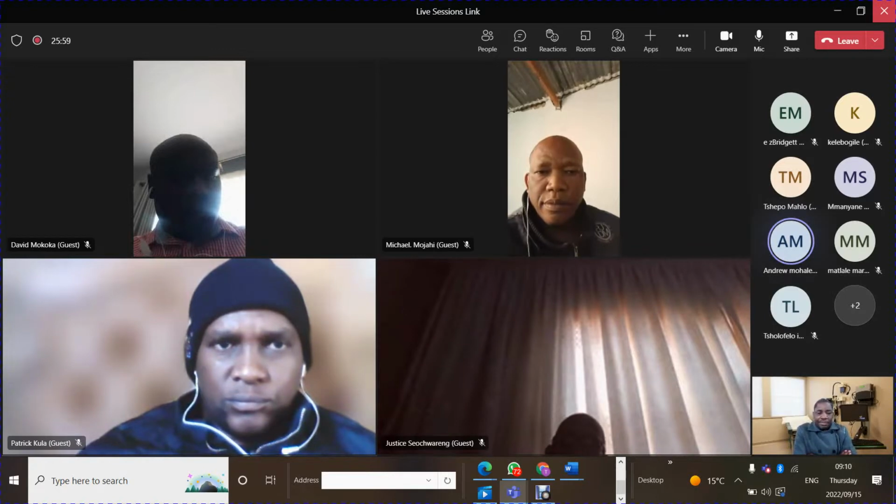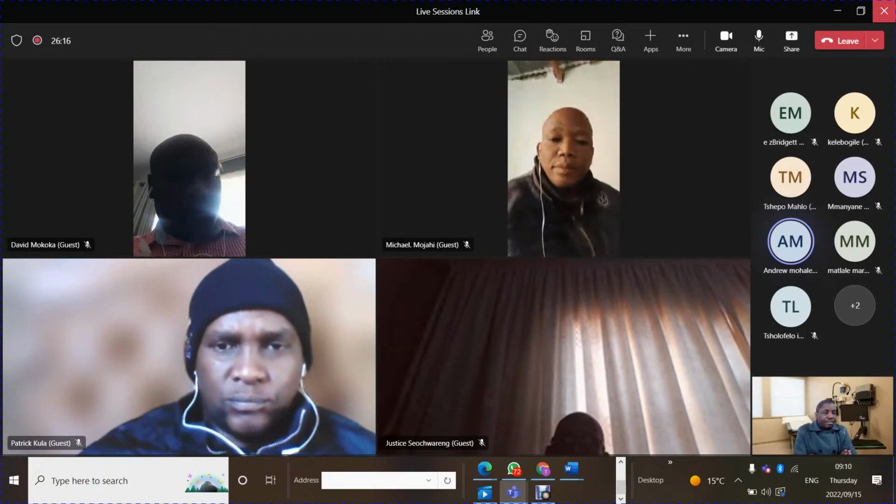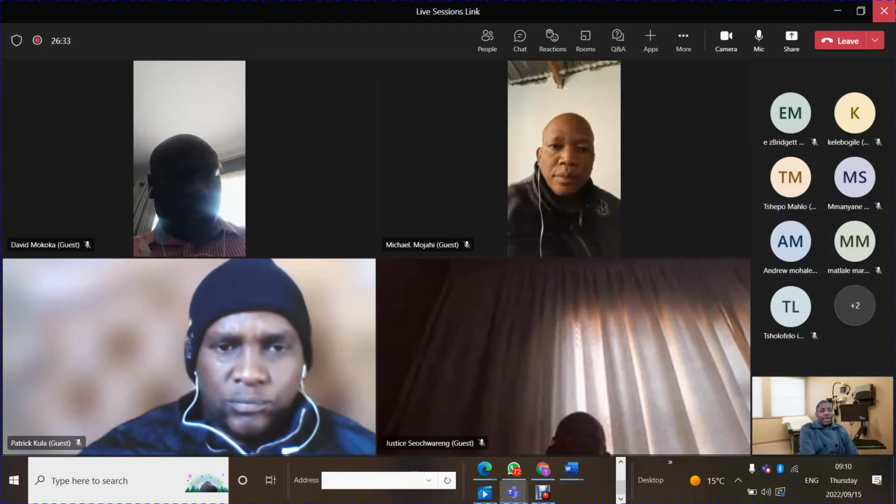Okay, so on the NIBP, according to the manufacturer's instructions, we normally use a tolerance of 10. It has to be based on the leak test first, because if you do the leak test and find it accurate, then the tolerance mustn't be over 10%.